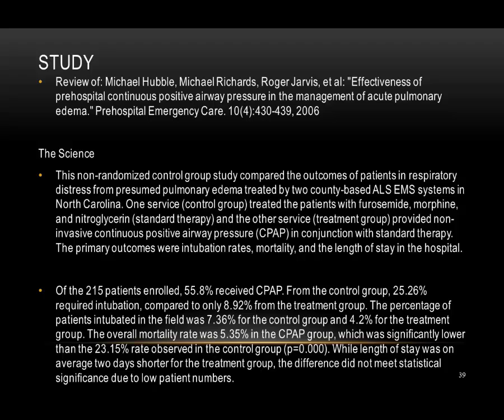Despite these dissimilarities and the inclusion of CPAP use in the patients not in acute pulmonary edema, the CPAP patients still did better in all 3 outcomes compared to the standard therapy. Though not statistically significant due to the low numbers, the patients in the control group who were placed on CPAP after hospitalization also had a lower mortality rate and need for intubation when compared to those who did not receive CPAP at all.